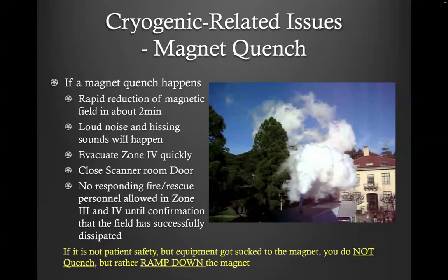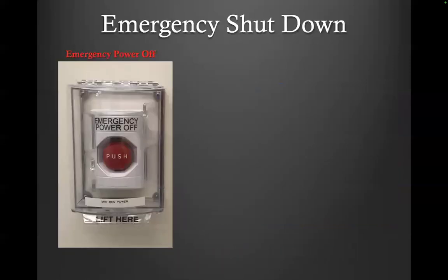If it is not patient safety, but equipment got stuck to the magnet, which also happens, you do not quench the magnet. You can do something much more gracefully by asking the service engineer to come out and ramp down the magnet, which takes a few hours, and they will gradually reduce the magnetic field. But then you don't have this rapidly boiling off helium problem. Okay, so magnet quench, don't do that. I hope nobody ever needs to do that.